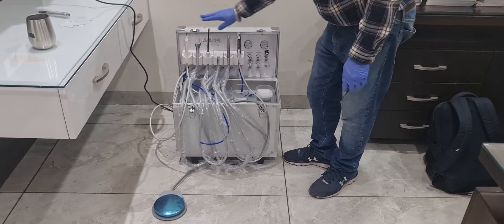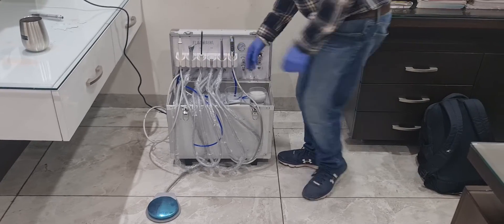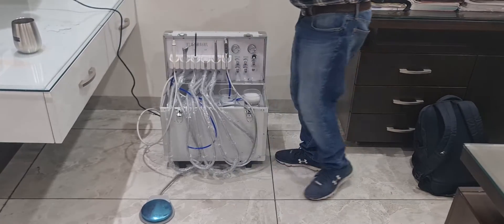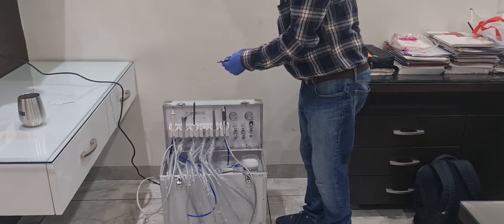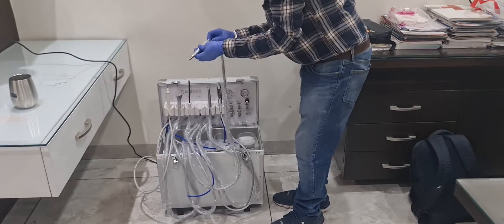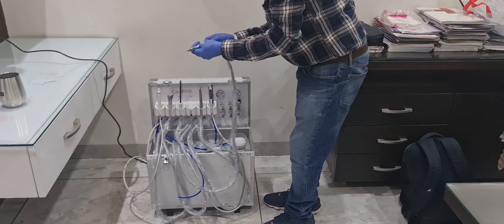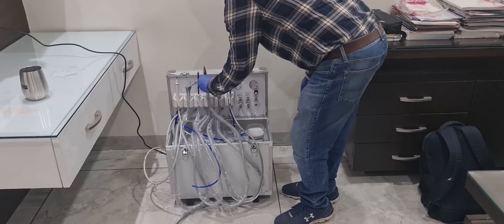So here is the light cure, scaler, 3-way, suction, and two air rotor points — or you can also use an air motor. With this you can attach a straight handpiece or a contra-angle handpiece like this. So this is a complete all-in-one solution for the clinic.